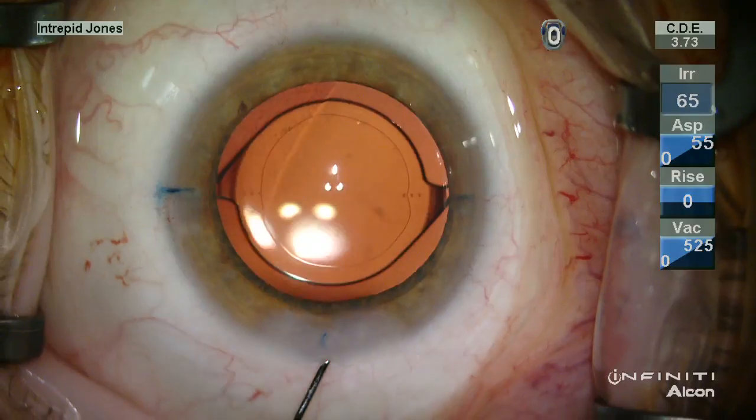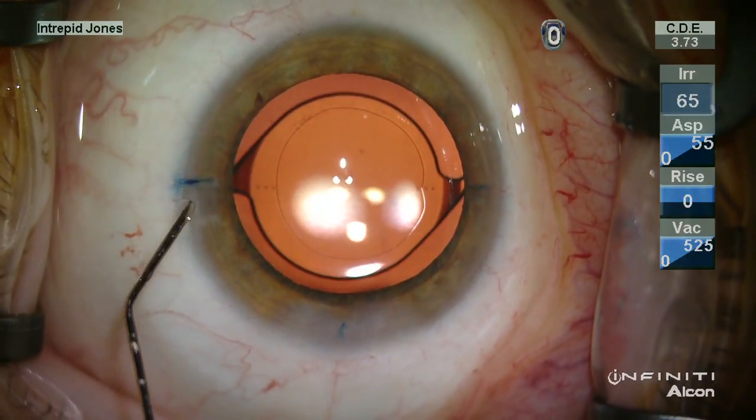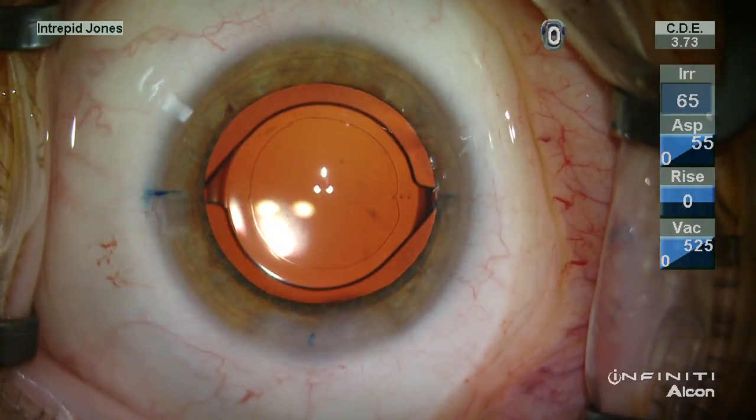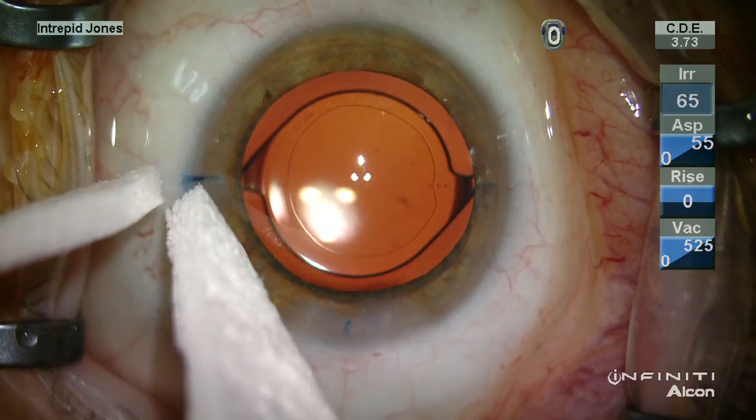And as you can see, this leads to a very cleansed capsule, which I find reduces inflammation, lessens PCO, and provides for an easier opportunity for IOL exchange if the need arises.